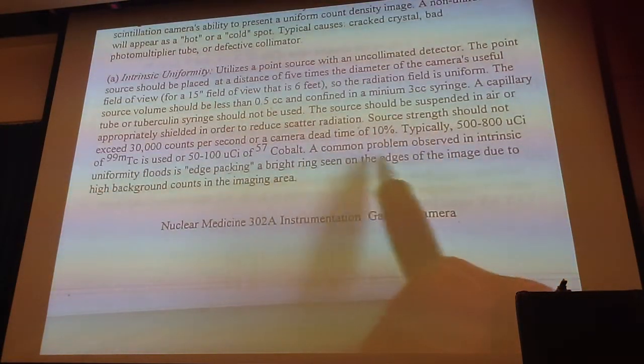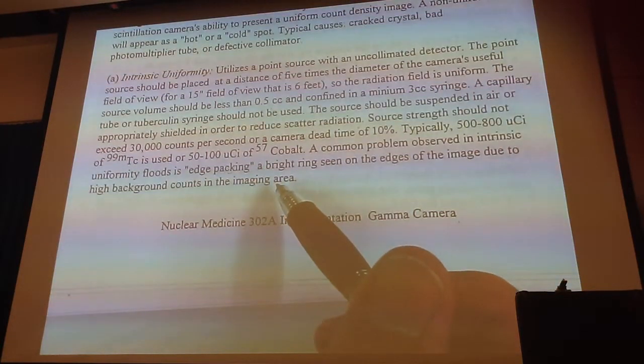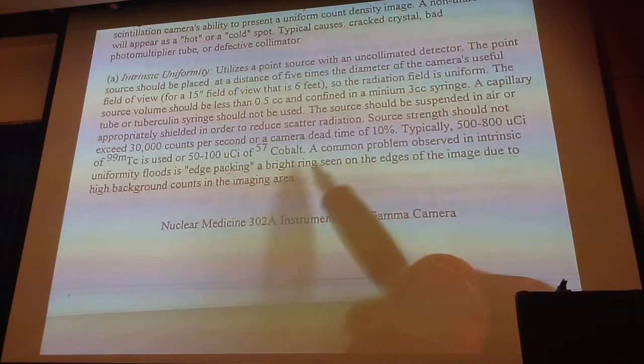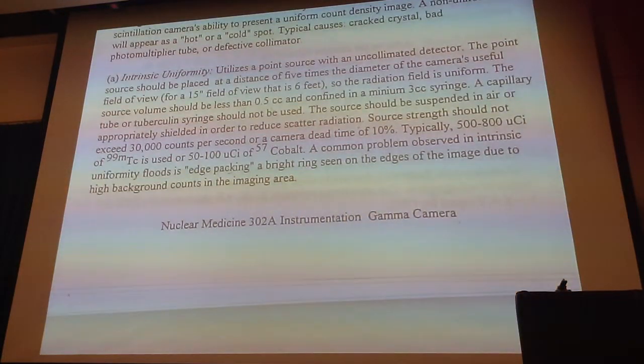And then the other problem you run into is the edge packing. You all remember what edge packing is? Mr. Villa, what is edge packing? Sounds familiar. Do you see any edge packing on this image?